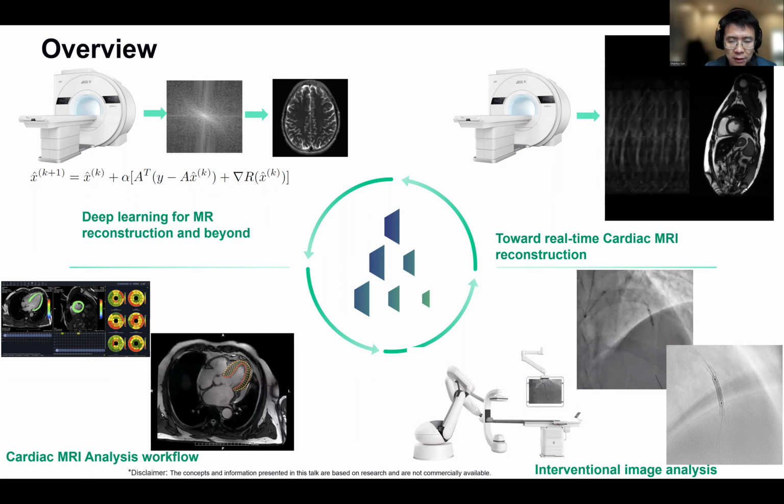We utilize the convolutional neural network, and we all know a convolutional neural network itself introduces an inductive bias, which can be interpreted as a prior for the inverse problem. We propose a pyramid convolutional recurrent neural network for MR reconstruction.